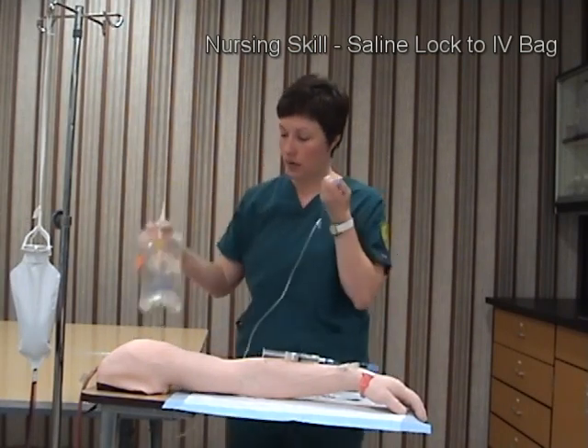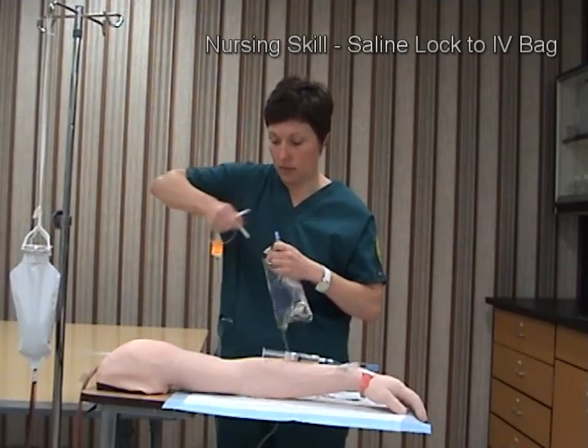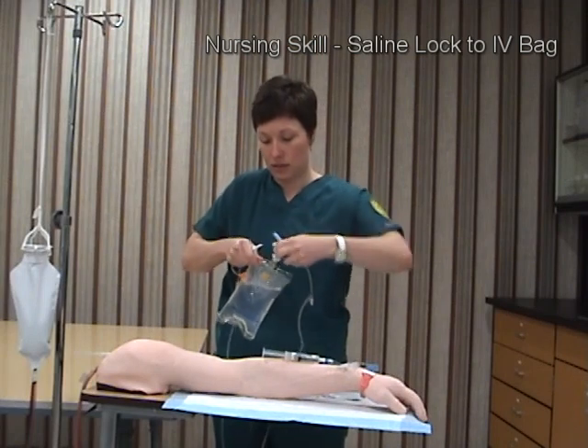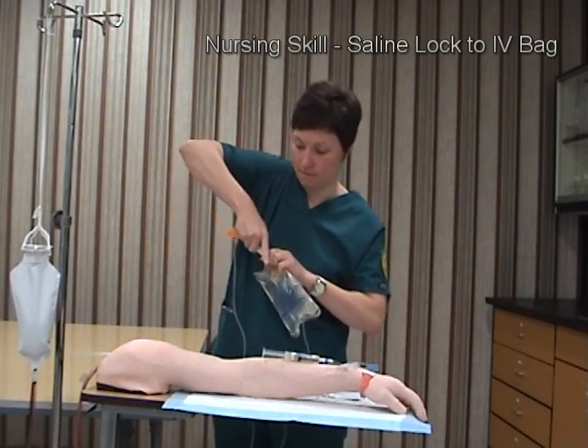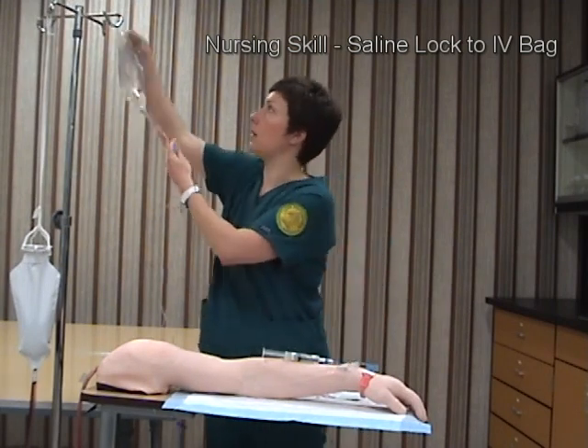I've already verified my IV solution and it looks good. I will aseptically connect my spike to the IV tubing, then invert the bag and hang it on the pole.